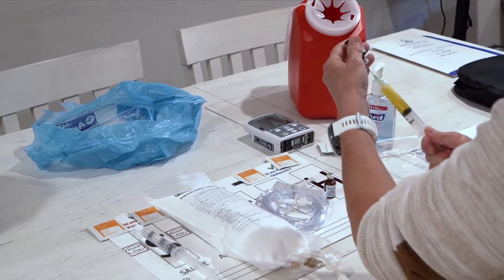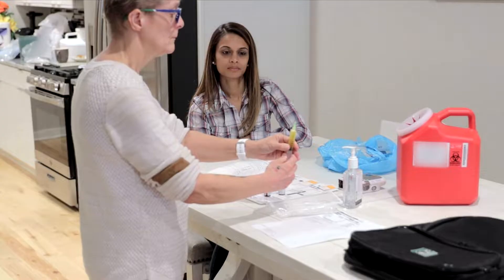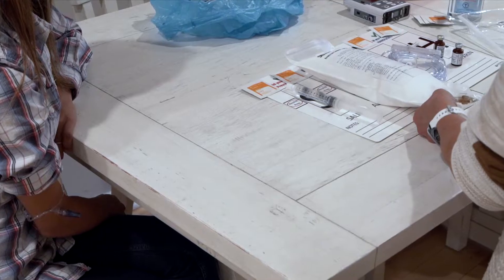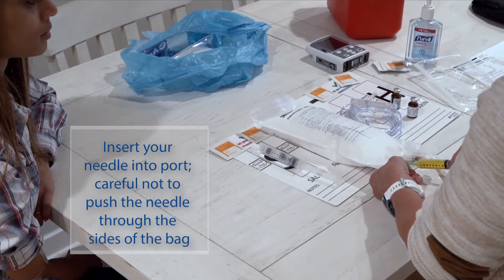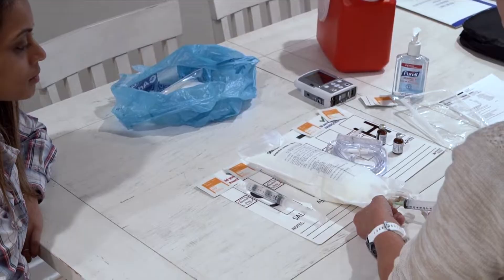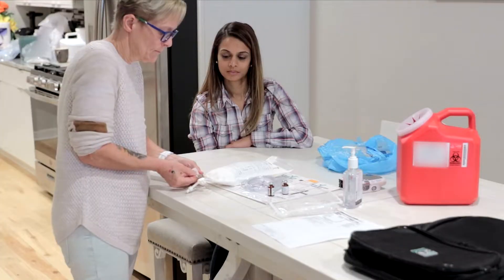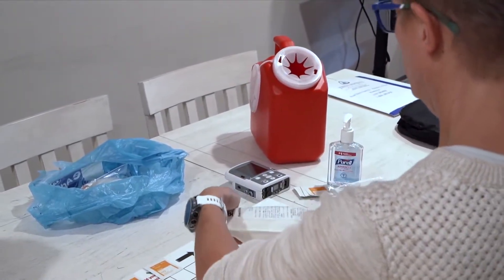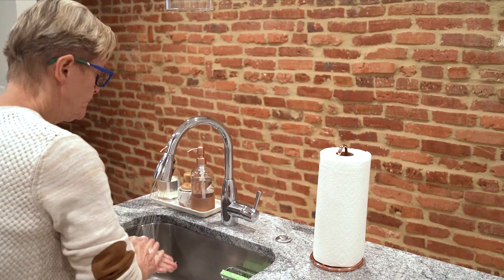When you have drawn up all the medication you intend, remove any air left in the syringe by holding the syringe with the needle facing upwards. Push the plunger in slowly until no air is left in the syringe. Push the needle into the center of the port carefully, not pushing the needle through the sides of the bag. Push the fluid in the syringe into the TPN bag by pushing the plunger in until the syringe is empty. Remove the empty needle and syringe from the TPN bag and put it in the sharps container. Clean the port again with an alcohol pad. Repeat these steps for each injection of additives. When done adding all additives, rub the bag with your hand or gently rock it back and forth to make sure all the ingredients are mixed. Do not shake the bag. Wash your hands.